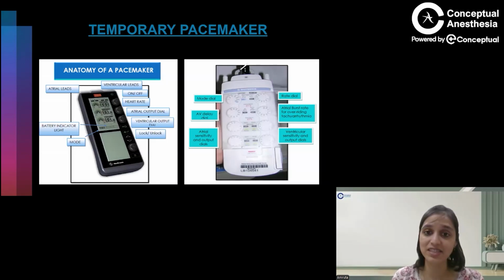You all must have seen a temporary pacemaker. On it, you will see this is your on-off switch. We'll go into the details of it; I'm just telling you what parts of the pacemaker show you. There are so many numbers which appear on the screen that it can become a little confusing or scary. So all we need to know is switch it on, set your heart rate, set your output here. How we do that, or what the output is, I will tell you in detail.